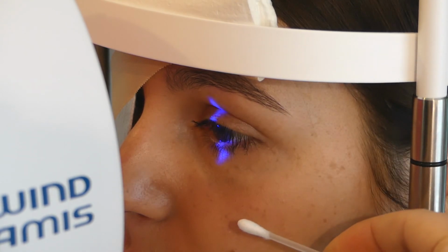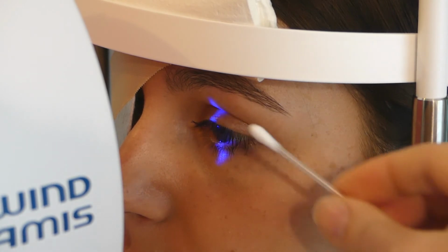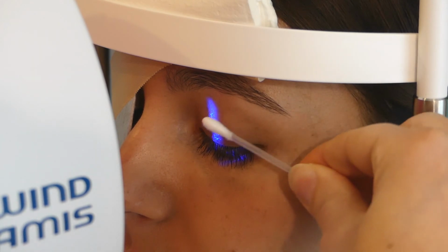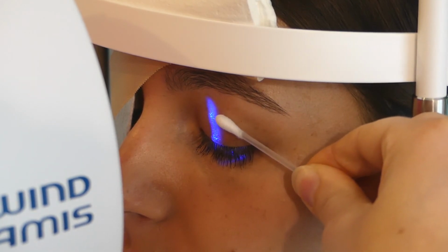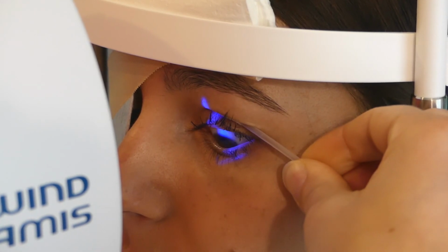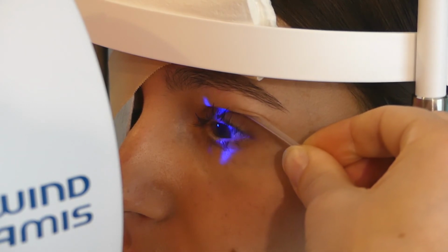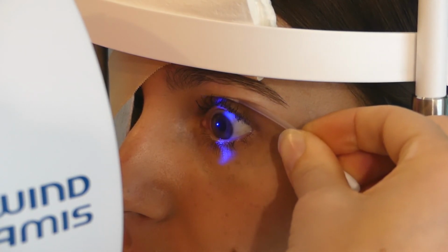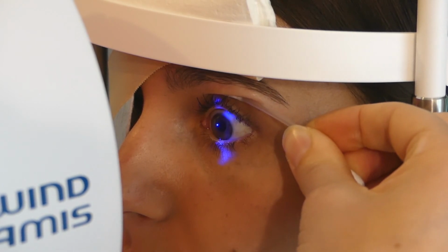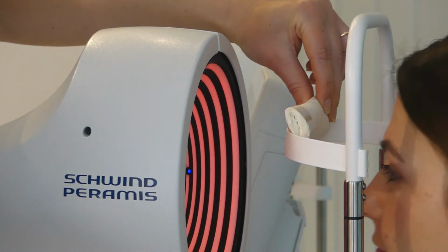In case the upper eyelid is covering the cornea too much and creates too much shadow, let your patient look down. Please look to your foot. Now I'm positioning the cotton stick here and rolling the upper eyelid without touching the eye, and I'm pressing on the orbita. So patient, look straight, and now you can open the eye manually without touching the eyeball. Okay, my measurements are finished now.